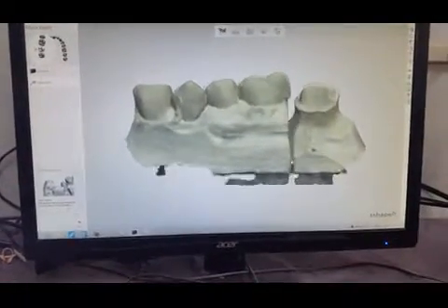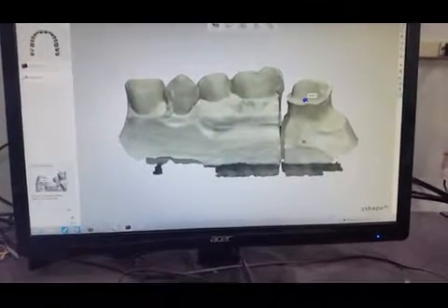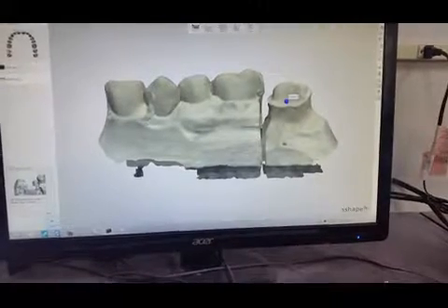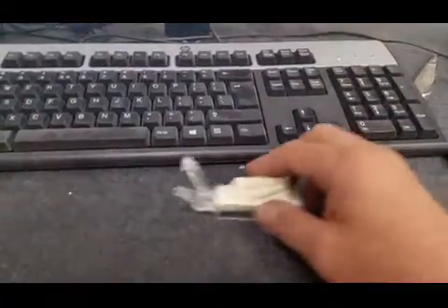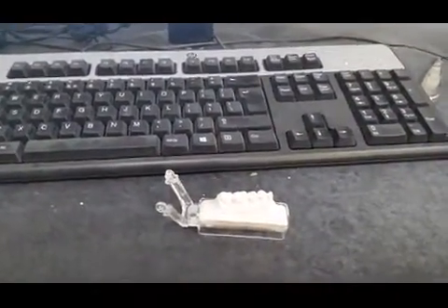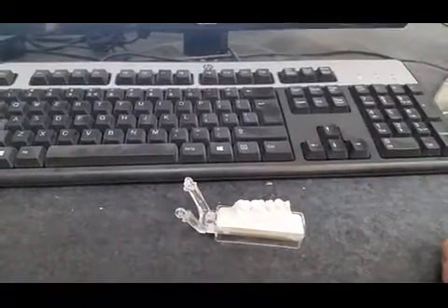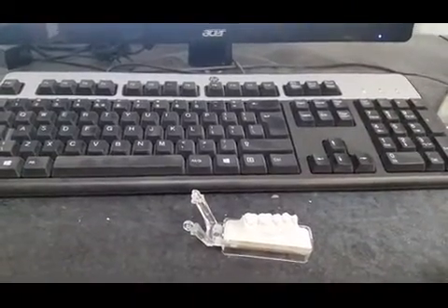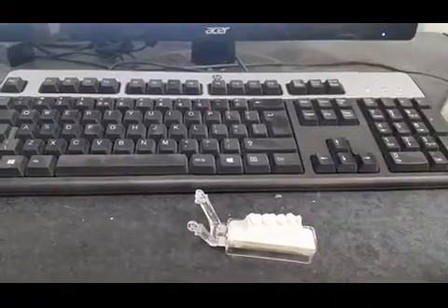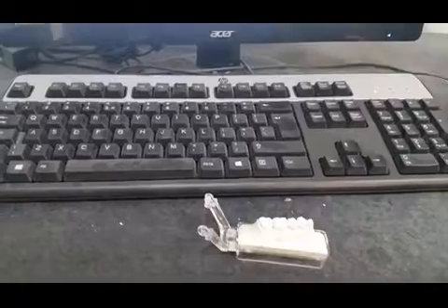Now it's asking me to select the teeth or tooth that we're doing, and we're doing number 2, and we're going to proceed. It's asking me here to put the opposing side, which is the other piece of the model, and we're going to scan that. Then it's going to ask me to scan the bite, which is both of them together, and we'll scan that, and then it'll scan the die or the prep tooth by itself to pick up the margin, and we'll scan that.